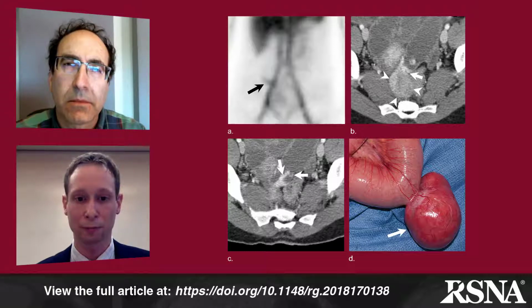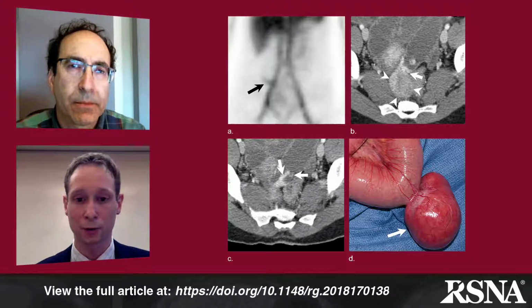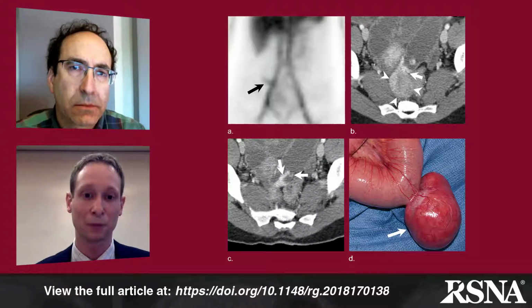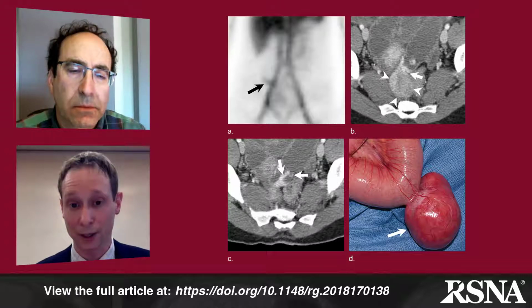We were able to confirm the absence of any metastatic disease in the abdomen. Our gastroenterology and surgery teams were happy with this amount of information, so they ended up avoiding a colonoscopy to work up lower GI bleeding. They didn't go to fluoroscopy. They ended up going straight to the operating room. There they were able to resect the tumor, and this ended up being confirmed as a gastrointestinal stromal tumor.